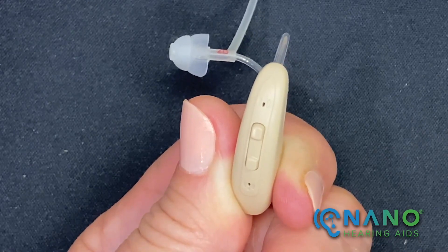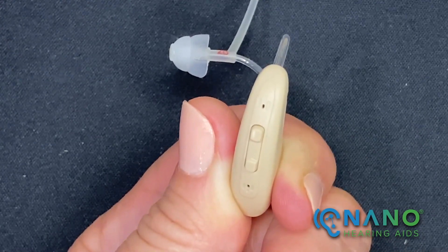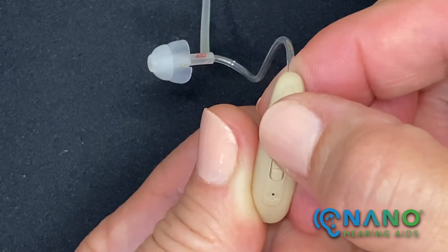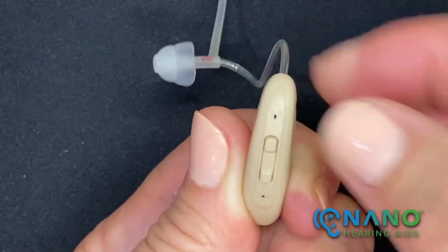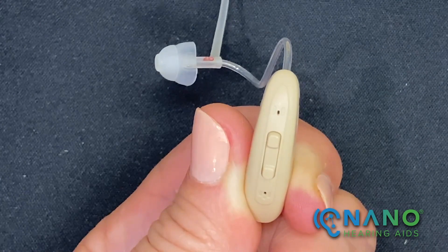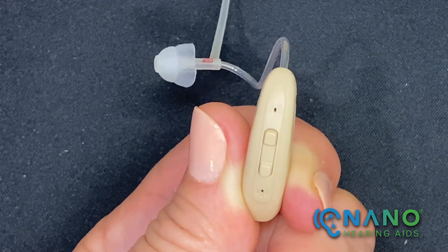To change the program, press and hold the upper button for three seconds. You'll advance from programs 1 to 4. You'll hear the number of beeps that corresponds to the program selected: one beep for program 1, two beeps for program 2, and so on.